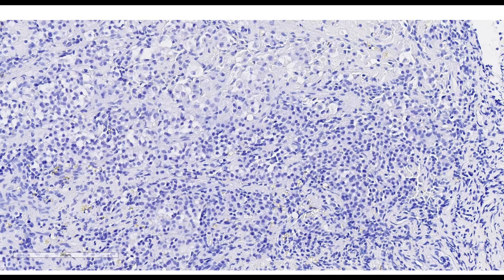All right, anyway, look at the upper middle half. You see those big foamy cells, those are macrophages, CD163 positive. Not gonna show you the immunostain, we did run it. The rest of the field, the lower half, all the way across, small, regular round cells. Here's a TTF1, stone cold negative.